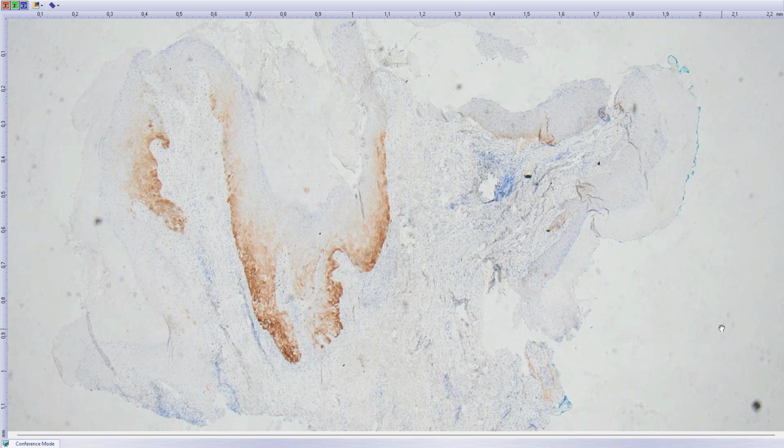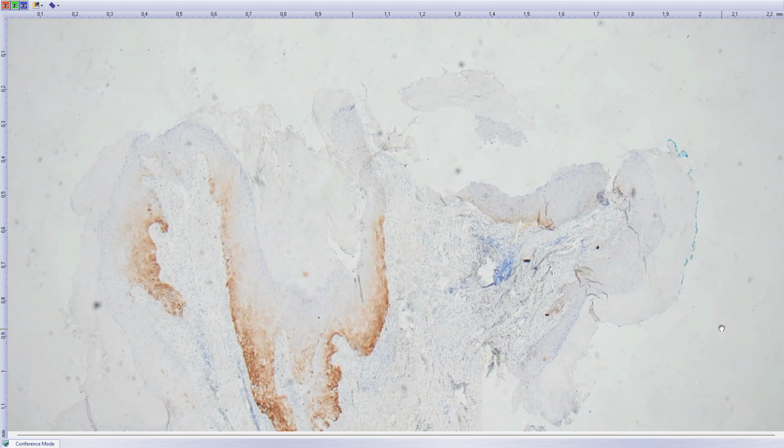When you have a patient having lichen sclerosus or differentiated type of dysplasia, this epithelium is much more susceptible to any injury, and then it is much more susceptible to any HPV infection. So it's very understandable that you see two pathways at the same time, and sometimes it's difficult to distinguish whether it's HPV-related invasive cancer or differentiated type driven squamous cell carcinoma.